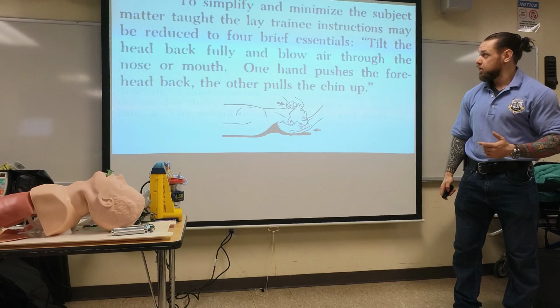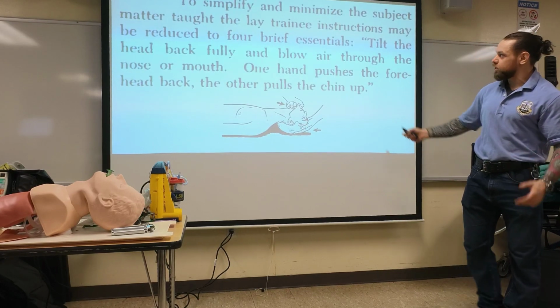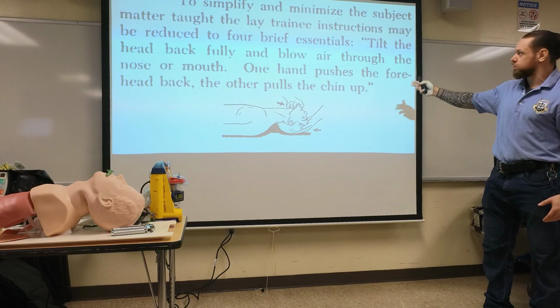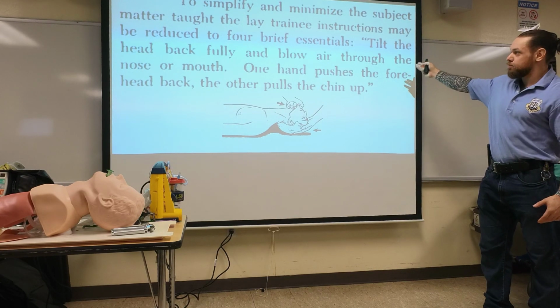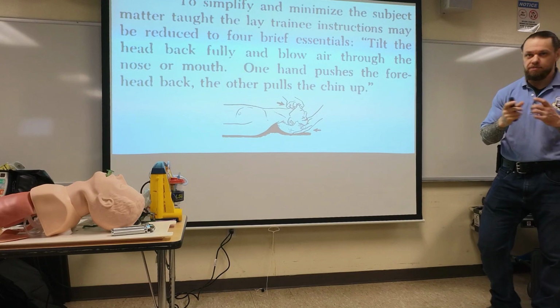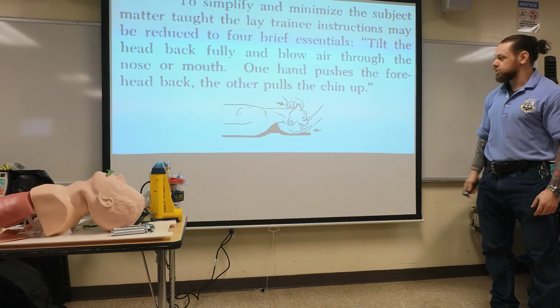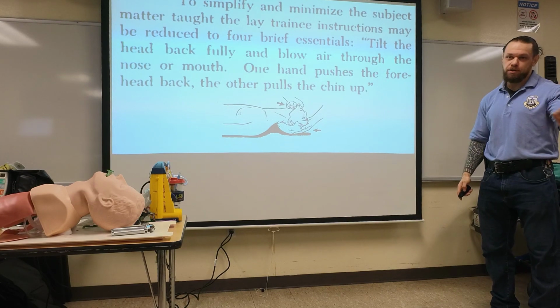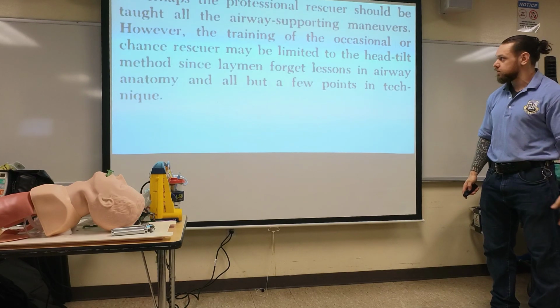For you guys, they said it's much easier to minimize the subject matter taught: just tell them to tilt the head back fully and then blow through their mouth and nose. This was before they had the masks and all that. This is easy to teach. Tilt the head back, you blow, and it's good for a layman, somebody who's going to do compressions, and that's fine.